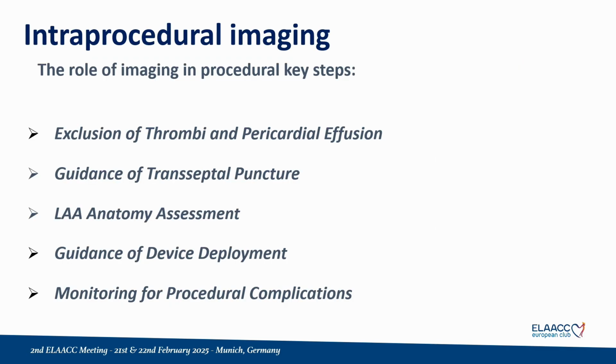Okay, but let's go back to the slide of my previous presentation. How the 3D ICE can address all the points of the procedure.